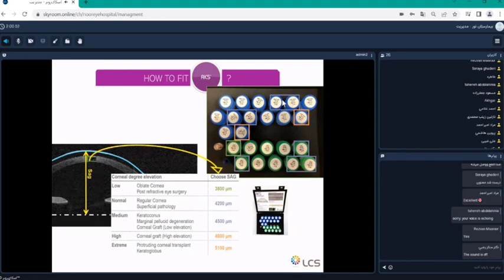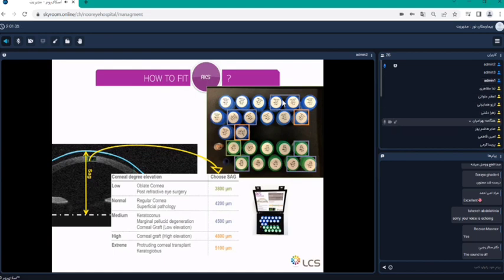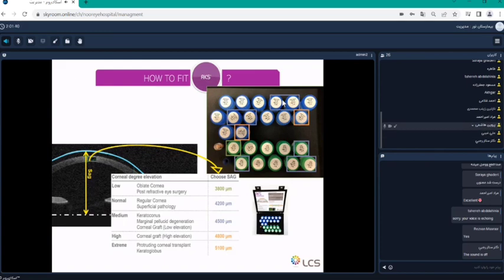The reason why we have torics with the larger diameter 16.5 is because when you have a larger lens, you go farther away from the limbus. When you go far away from the limbus, you have more toricity in most of the cases. This is linked to the pressure of the lids and also the insertion of the eye muscles, which affect the toricity of the global eye. So that is the reason why it is really rare to have a large diameter 16.5 spherical. You have them, but this is rare. In 10% you can find that.